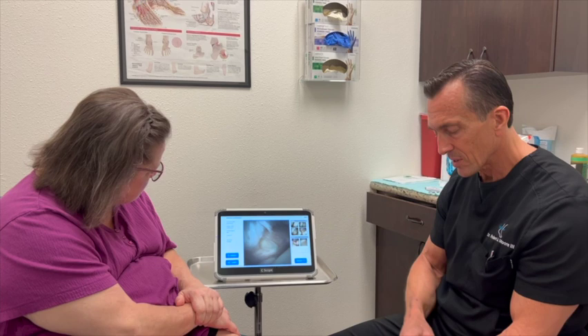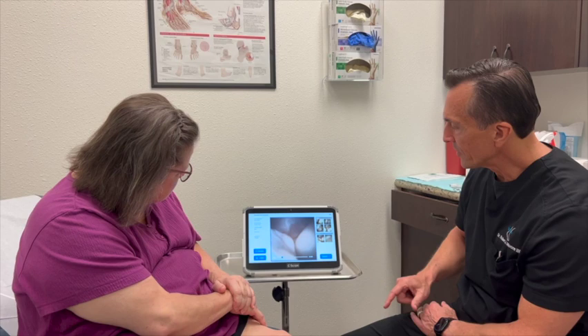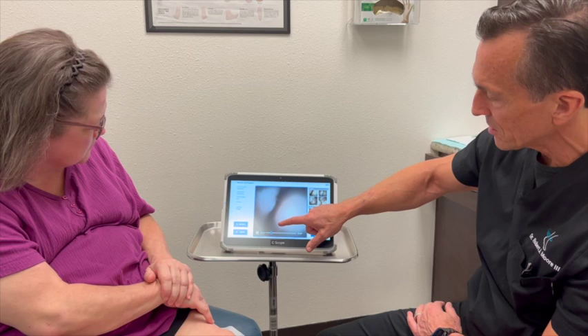The other good news is down here — that's your ligament on the outside of your ankle, nice perfect condition. And then this was another shot of it on the side, and another video showing coming across the front. There's some of that detachment, but the other cartilage looked really good over here, and then as I came across I saw a little bit of detachment there.